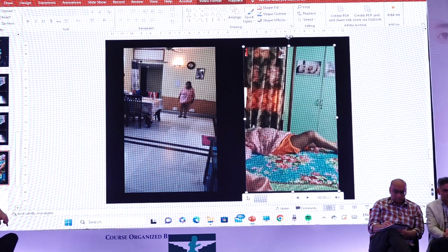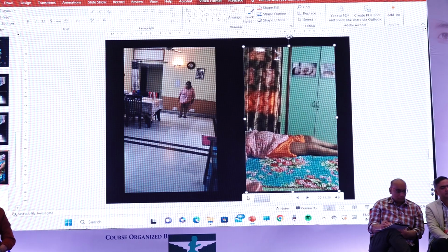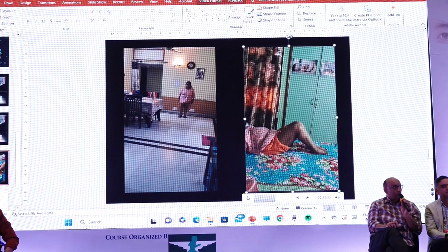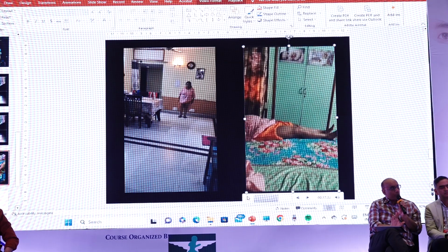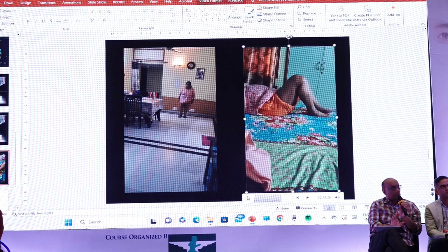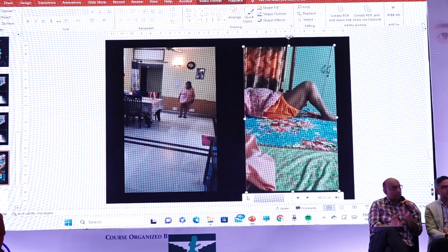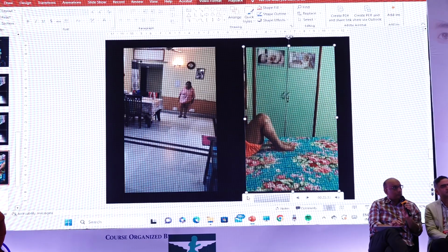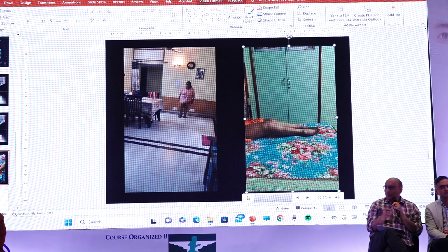You had to do some soft tissue release in this case? No. Fortunately, it was severe deformity, but largely correctable. So, Dr. Arora, what was your pre-op valgus? Pre-op valgus, about between 15 and 20 degrees. So, I just want to ask the panel here: if you have 15 degree valgus, what should we be aiming at for the end result?